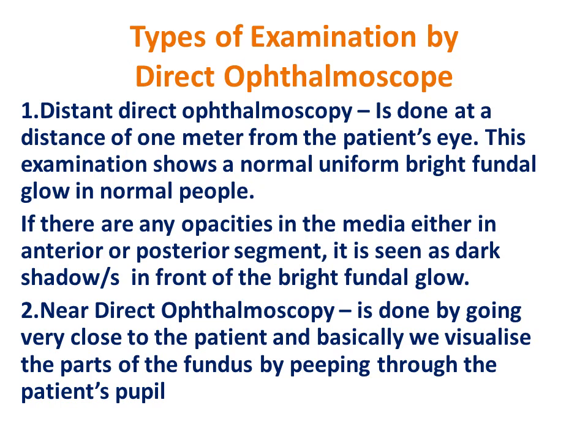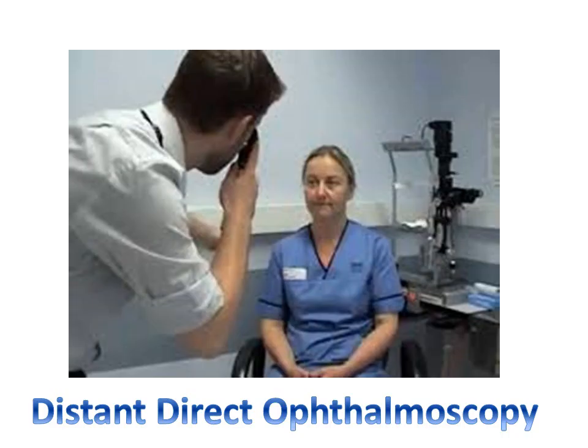Near direct ophthalmoscopy is done by going very close to the patient, and basically we visualize the parts of the fundus by peeping through the patient's pupillary area. Here you have to go extremely close to the patient so that you can see the structures in the posterior segment, namely the disc, vessels, background retina, macula, and also the periphery of the retina.